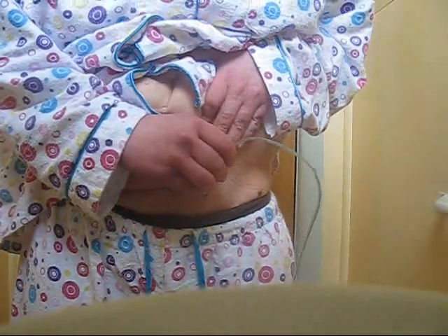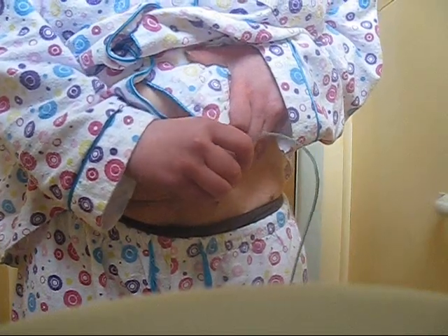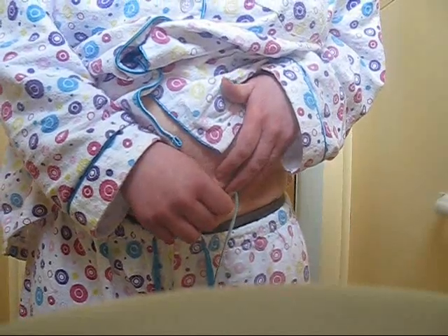It's in. But it's hit the bladder wall. If it hits the bladder wall — that's painful. There we go. A little pop there.